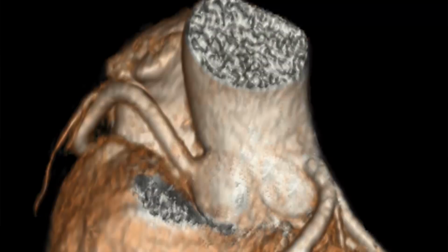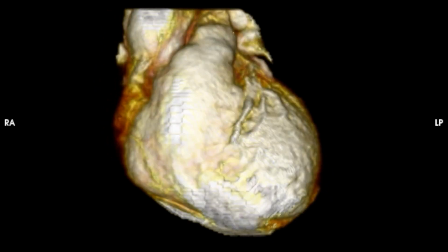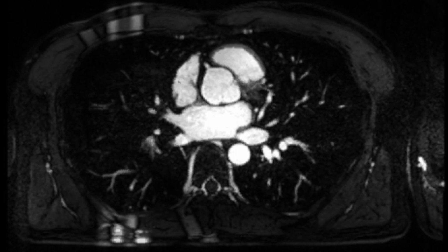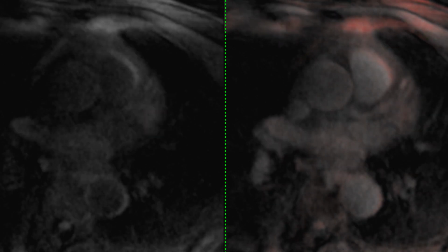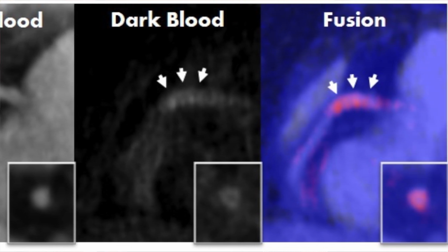More recently, it's been shown to be able to look at coronary stenosis or even at the characteristics of coronary plaques. Detecting coronary artery disease and the plaques along the coronary wall is a very challenging task because of the motion of the heart, the need for high spatial resolution, the need for high tissue contrast, and the long imaging time. We have overcome these challenges by developing novel techniques based on imaging physics and image formation theories, and demonstrated that we can accurately detect significant coronary disease in patients of the entire heart within 5 minutes.